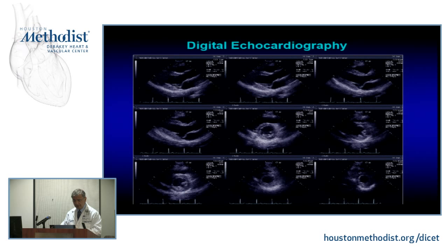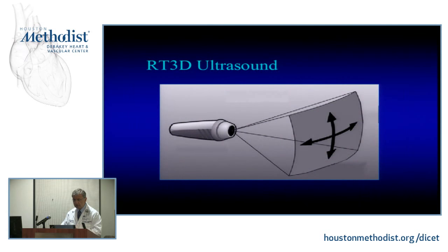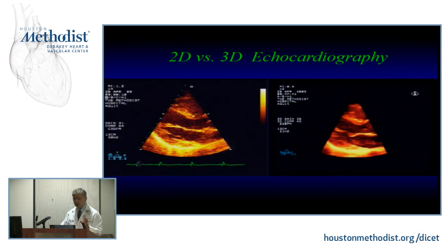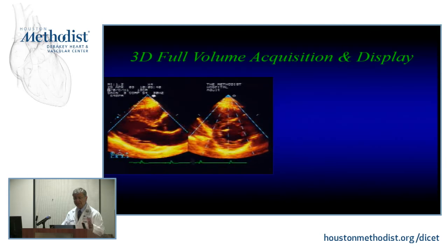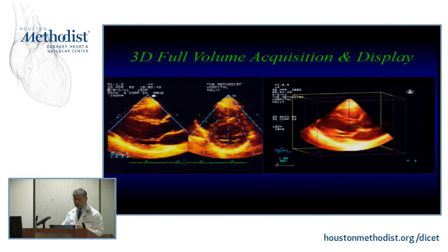And in our lifetime, certainly 3D is here, so I think 3D is really very important for us going forward. One thing is it will slow your frame rate down. There's no question about it, right? Because you're imaging in multiple directions at the same time. You have a C-plane that you can image from. In the past, this is how we started. You had to basically do fusion of sequential beats, so they're not the same, so you may have some stitching artifact, if you will. But nowadays, most of the time you could do it with one beat, and that is certainly very helpful.